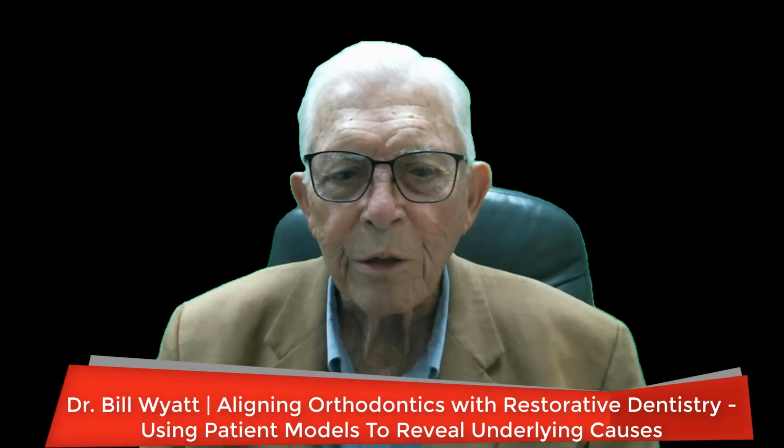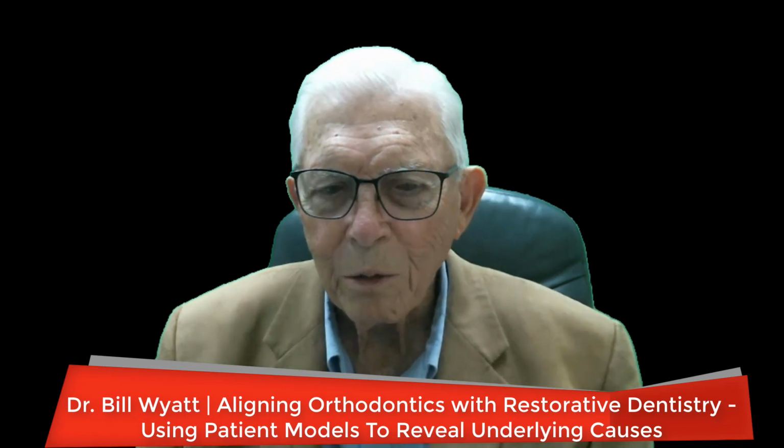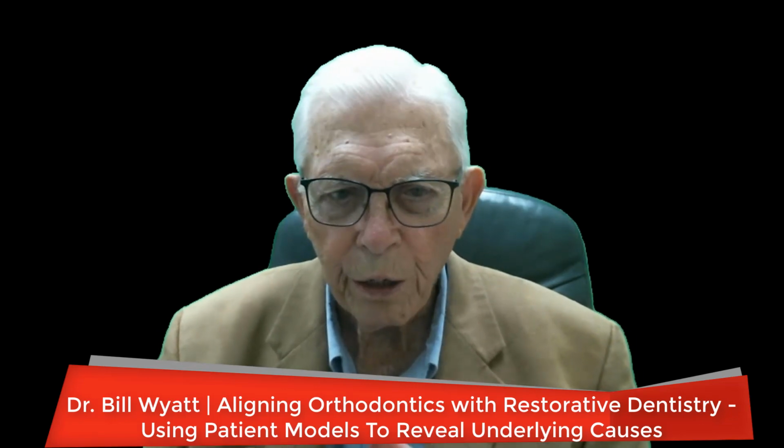Well, greetings again. This is Dr. Bill Wyatt, and we're in adult orthodontics. This young man is an engineer for some company, and he has had a problem all his life, and he just finally decided to try to do something with this.